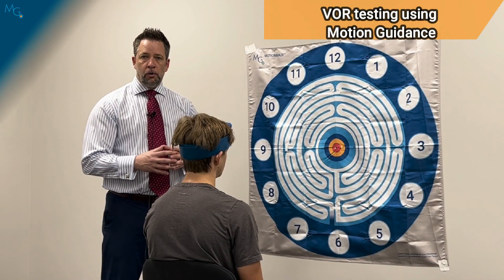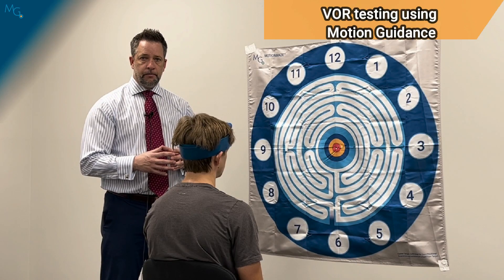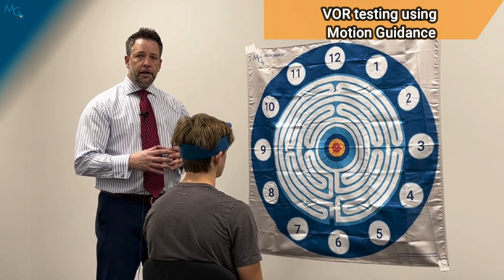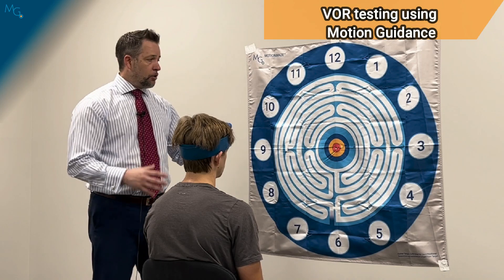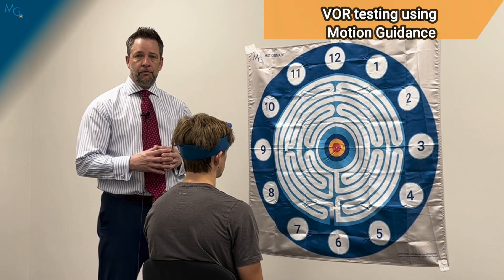Let's discuss the VOR portion of the VOMS utilizing motion guidance. Our vestibular ocular reflex has the horizontal plane test as well as the vertical plane test inside of the VOMS.